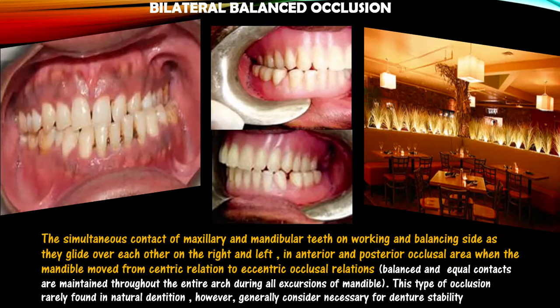طبعا هذا النوع من arrangement أو من occlusion يستعمل وين؟ بالcomplete denture حتى الضغط لما يصير lateral movement يصير ضغط متساوي على two sides حتى ما الدنشر يصير more stable during this movement. لذلك يستعمل وين؟ بالremovable complete denture. طبعا هيك نوع من الاوكلوجن بالفيكس يؤدي إلى ضغط قوي، ممكن يصير فورس بالاريا بالانس. ما نستعمله حقيقة بالفيكس prosthodontic لأنه بالبالانسنج سايد راح يصير كلش تروما to the teeth.